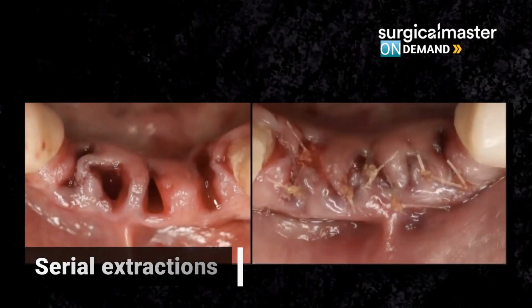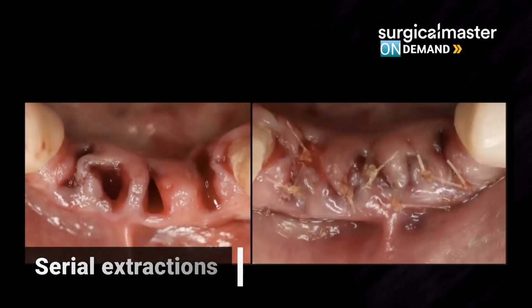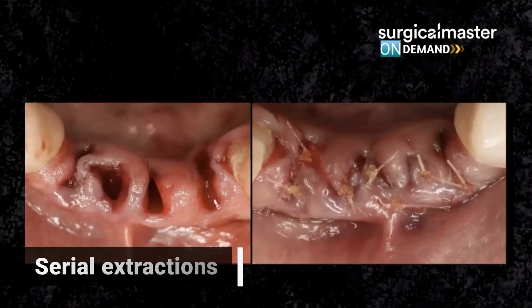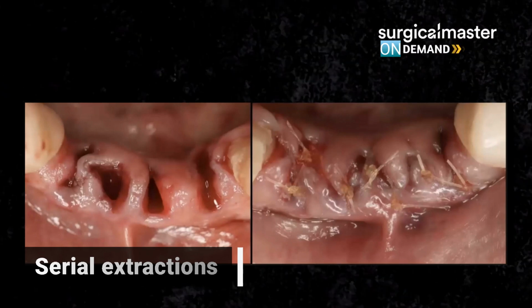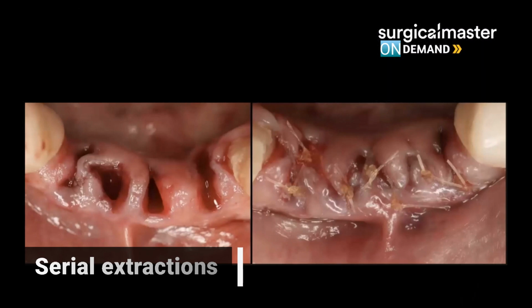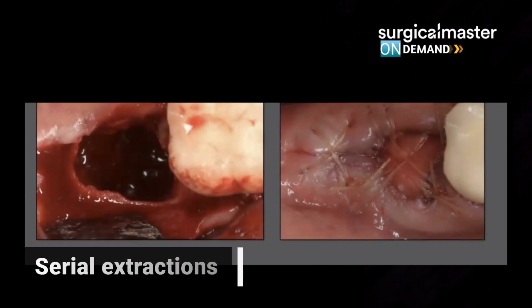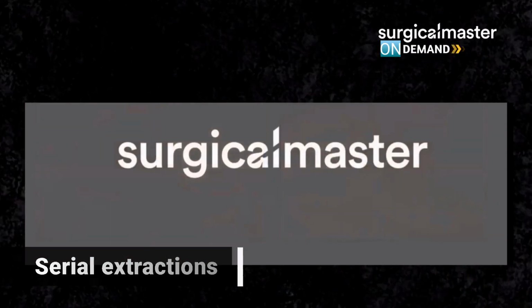Now, this is one single extraction. What if you have serial extractions? What if you have two molars side by side, or you have a molar and a premolar, or multiple incisors? The principle is usually the same, but don't be a robot. It doesn't mean that every extraction socket is going to look the same, because this extraction socket for a molar was very appropriate for an X suture.